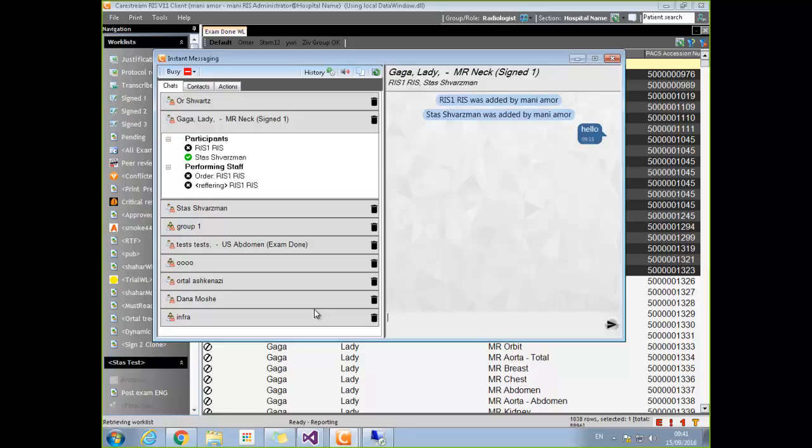Or do you think the radiologist would want that? We think a bit about them when we think about this, and not interfering too much with their time either. Maybe not so much with the radiologist. There's a lot of other staff that today need to call the referring doctor and ask something, or the referring doctor wants to add something to the conference. It's not mainly the radiologist.